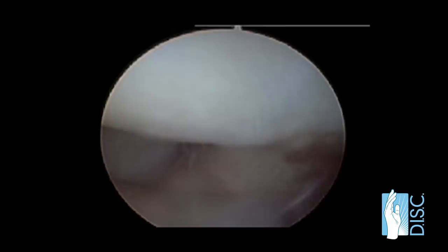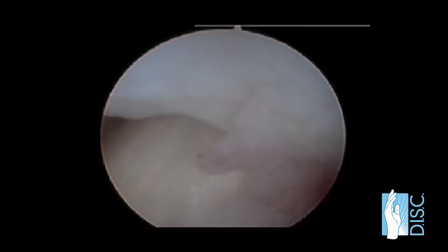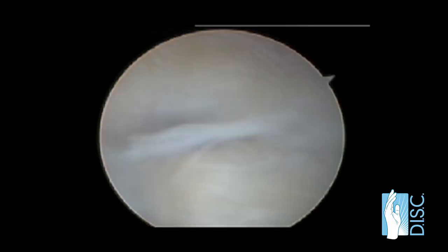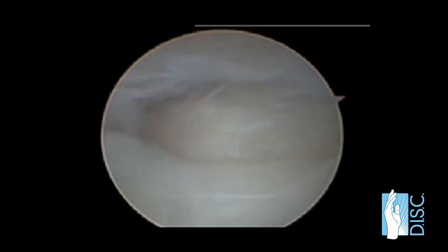And it will move from this portion of the wrist, the radial margin of the wrist, looking again along the front of the wrist to more of the extrinsic ligament system. Then we're going to sweep into the ulnar side of the wrist. That's the lunate fossa of the distal radius, now extending further ulnar, which is the triangular fiber cartilage, and this shows actually a tear of the cartilage, which is a degenerative tear. You can see all the fibrillation of the cartilage, and then that's the head of the ulna, which is the bone that articulates with the distal radius.